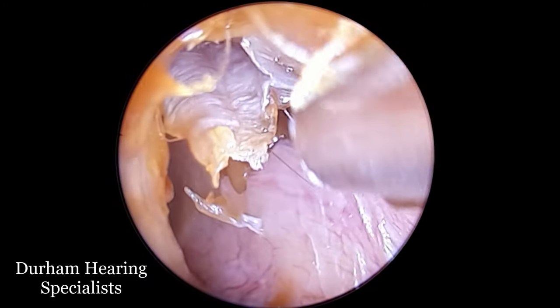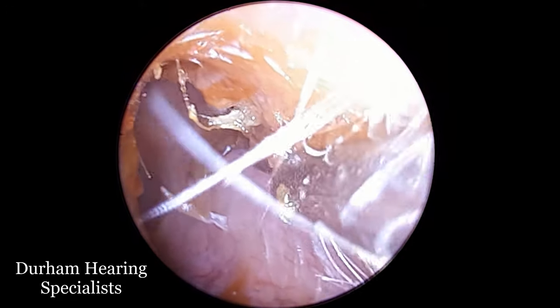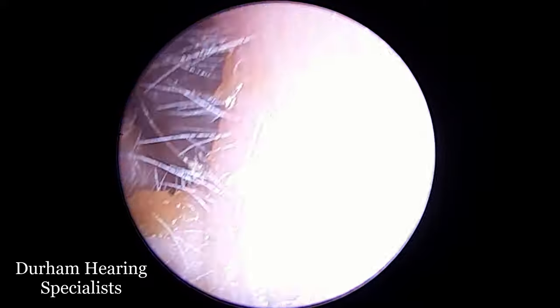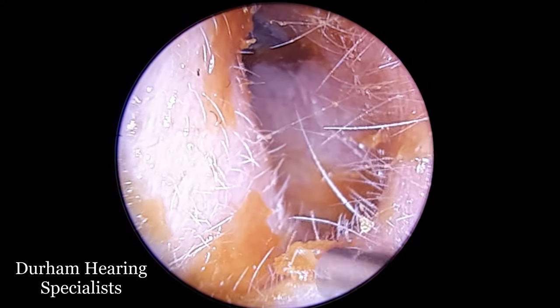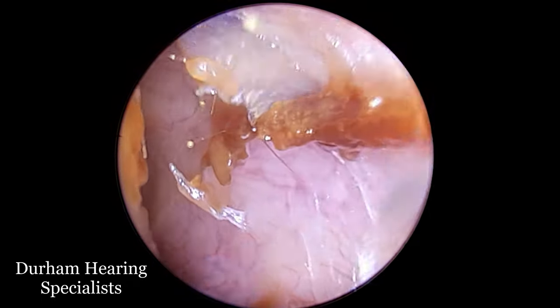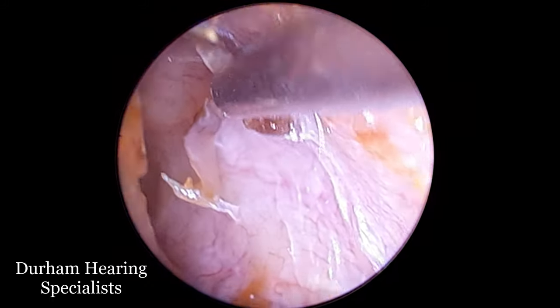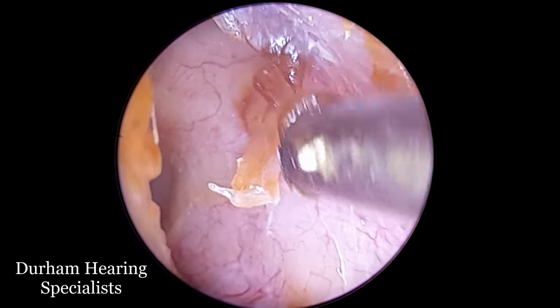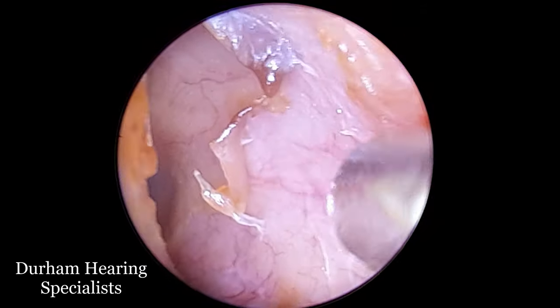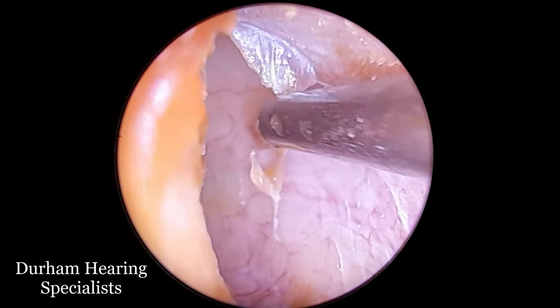Now we're just going to tidy up. There's some along the roof of the ear canal. Normally if this was just brown wax I wouldn't be overly bothered leaving some in there. If you look at most of the videos on this channel you'll see that I often leave wax in the ear canal because it has antimicrobial qualities, prevents the ear from drying out and becoming itchy, defends against foreign bodies, and has all sorts of benefits. But in the case of dead skin like this — particularly flaps of dead skin adhered to the canal — it's not overly useful to leave that in there; it has very little benefit at all.